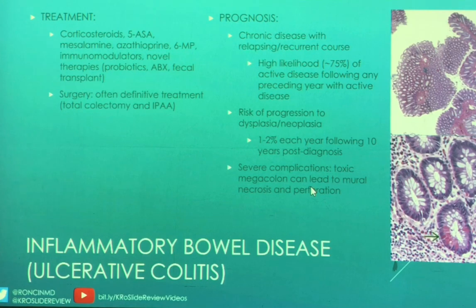So you just want to think about, we have this condition that's constantly irritating the mucosa, but it's not perforating all the way through, so we're getting this injury or insult to the mucosa, and then we have this reparative change, and it goes back and forth, so that's a really good environment, or prime environment, for developing dysplasia and carcinoma. As well as they can get things like lymphoma and stuff like that, but carcinoma would be more common.